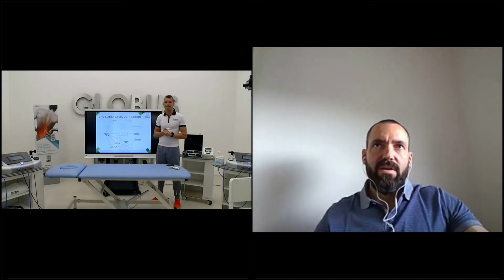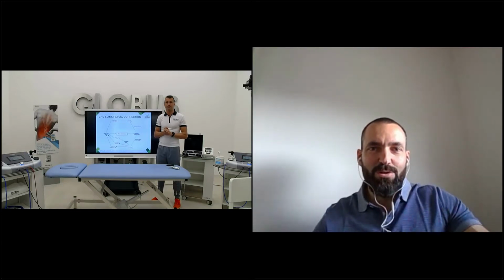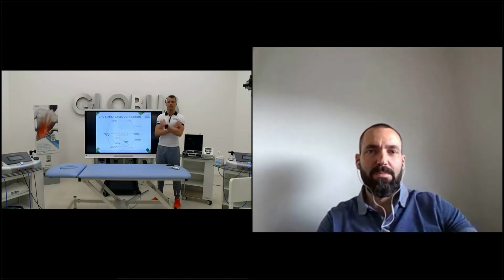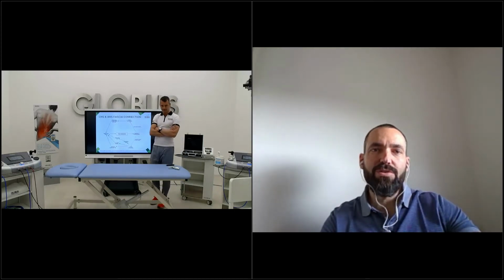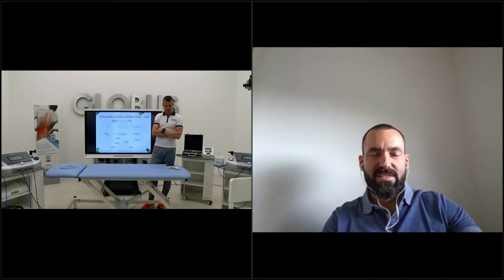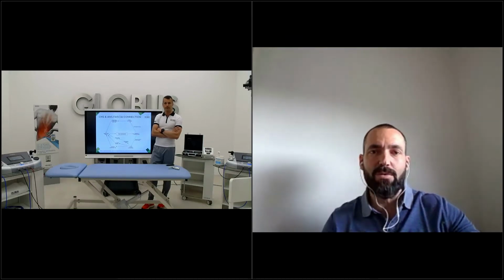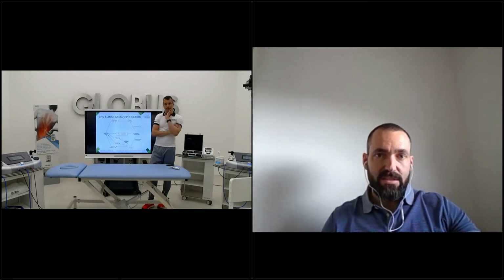Yes, as I told you, I like the deep treatment. When we make this kind of deep treatment, especially with fascial tools, improving temperature, you create some under-control inflammation, let's say like that. You improve blood circulation in that place. And after that, you have to give some break to these tissues, to this area that you treat. So I don't do it just before training, for example, or the day before the game.